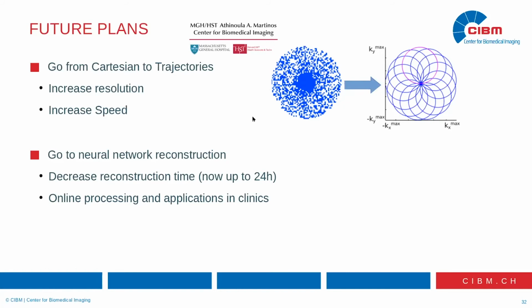And also we would like to leave our classical reconstruction scheme and go into a neural network, just for a practical matter. Now, typical reconstruction can take up to 24 hours for 3D data.